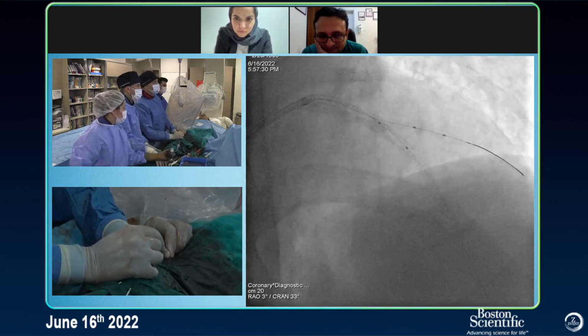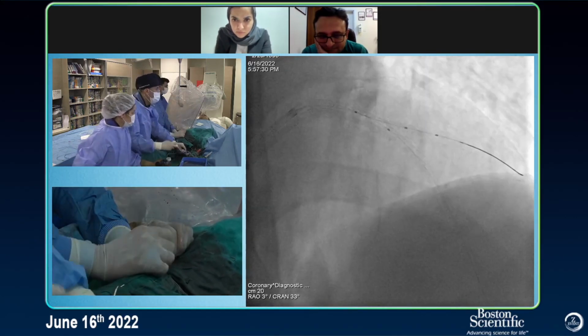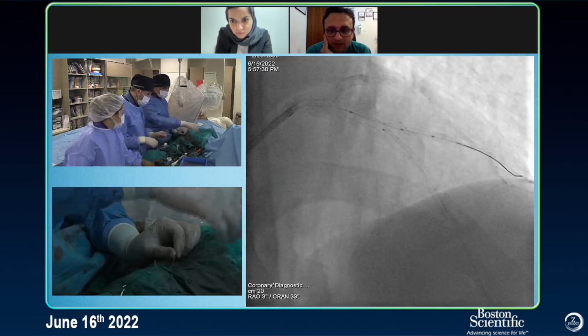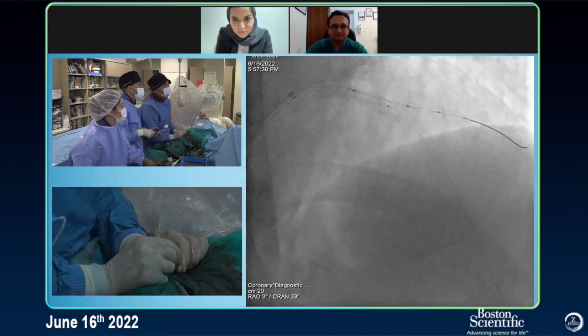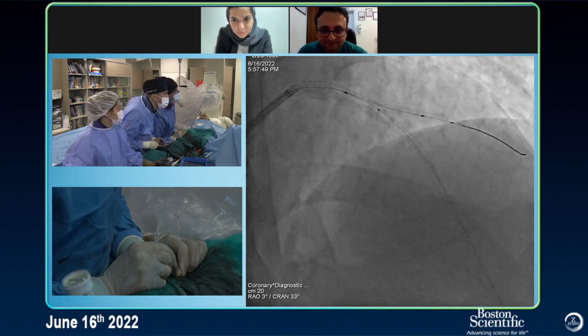I like to see the distal, because we do post dilatation. No problem. All right, LAD looks okay. We are very happy that we don't have rupture here. Let us do the distal. Hopefully we don't have any for the diagonal too. Yes, here is okay.